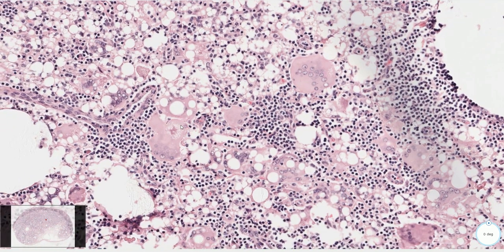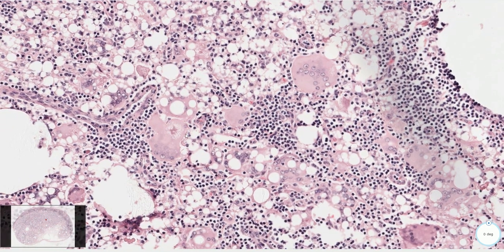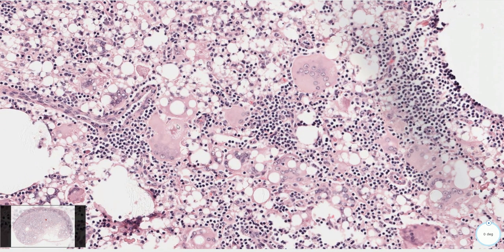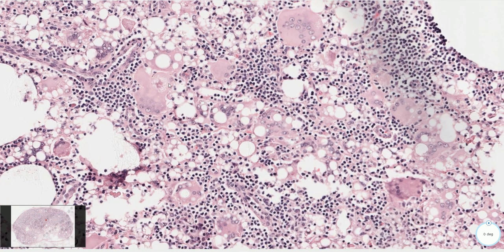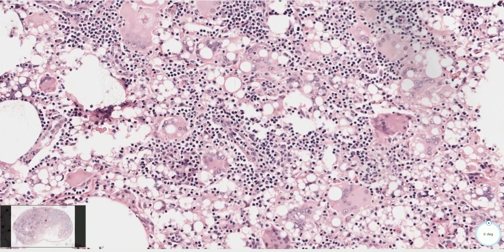Look what we have here. This is an asteroid body, which is typically seen in sarcoidosis, but we can also see this inclusion in cases of foreign body type granulomatous reaction.